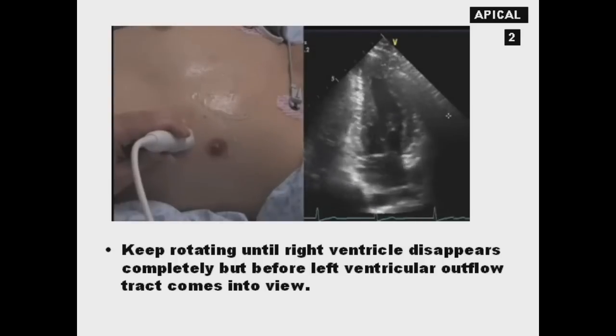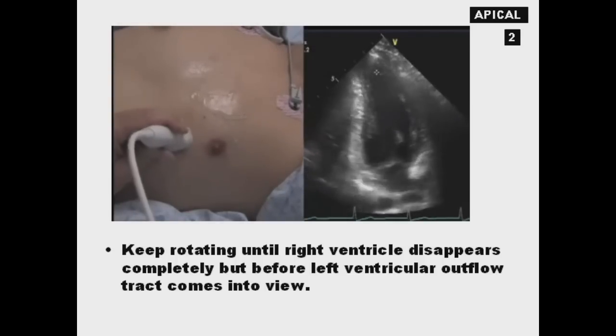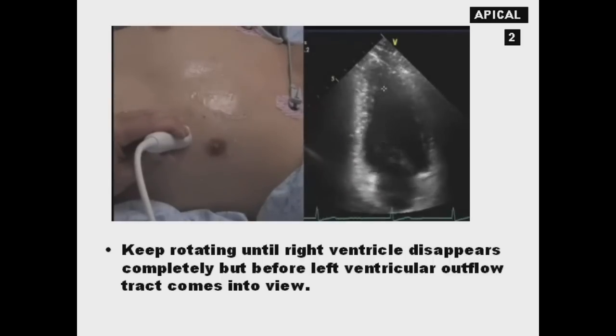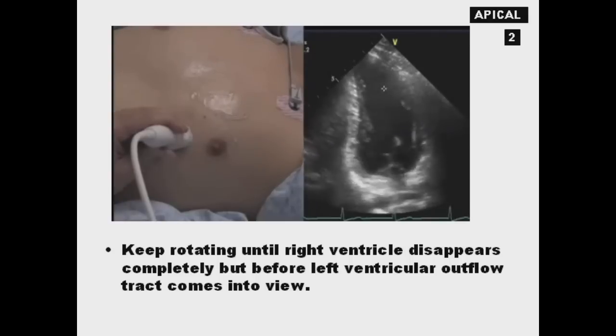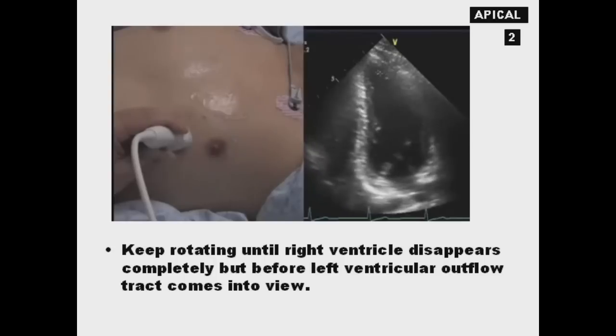And again, let's look at the apex here. This is a nice shot of the apex pinching off. If I adjust a little bit, just ever so slightly, look at the apex now. It is actually squeezing in like if it was a short axis view. That means I'm foreshortening my apical view. So you need to make sure you've got that opened up all the way. In every apical view, you want to see it more pinching than just squeezing in.